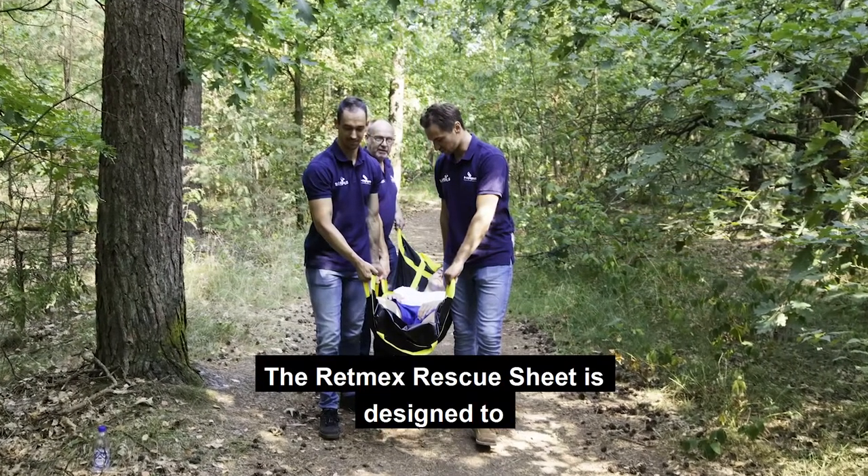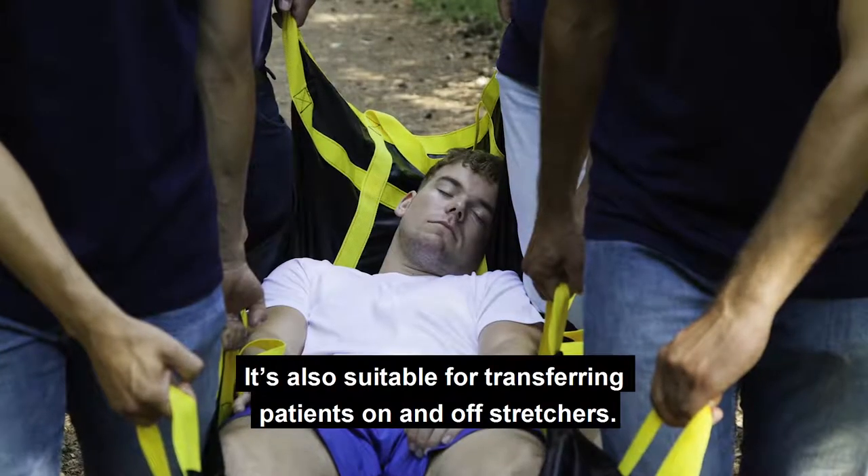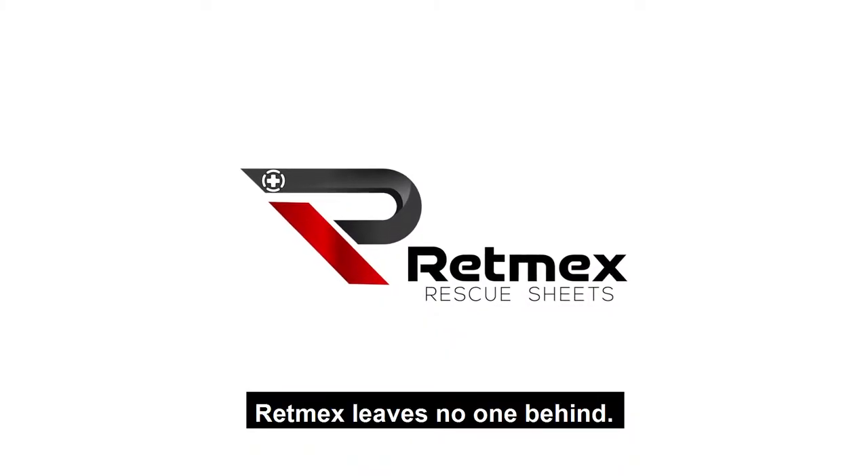The RETMEX Rescue Sheet is designed to transfer victims from rough terrain. It's also suitable for transferring patients on and off stretchers. RETMEX leaves no one behind.